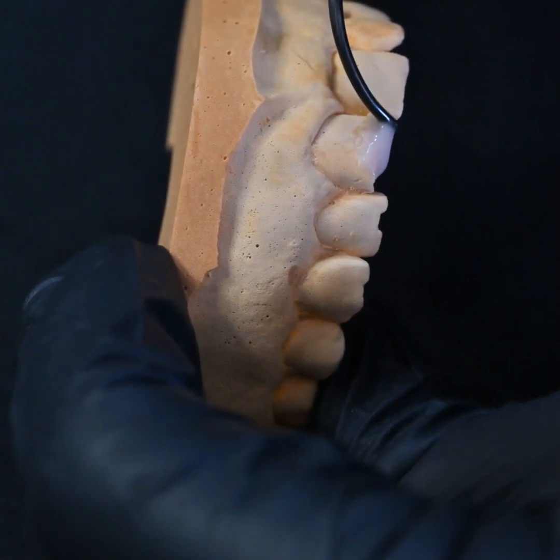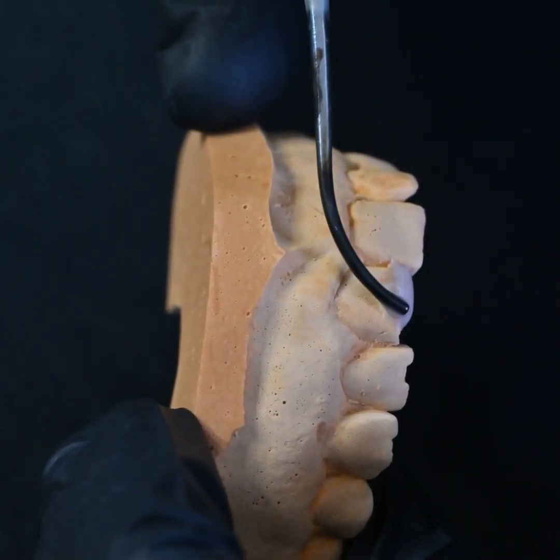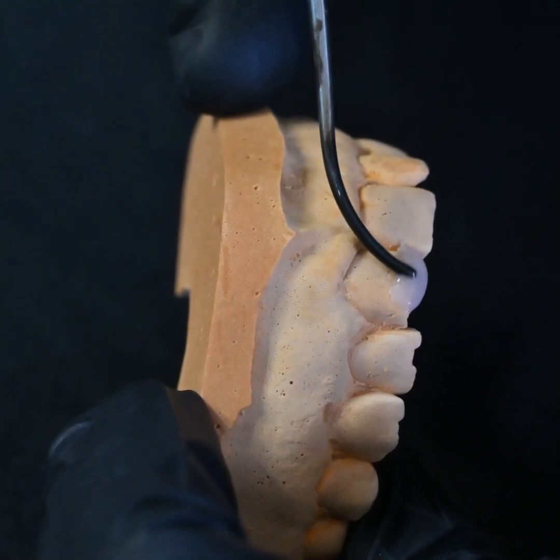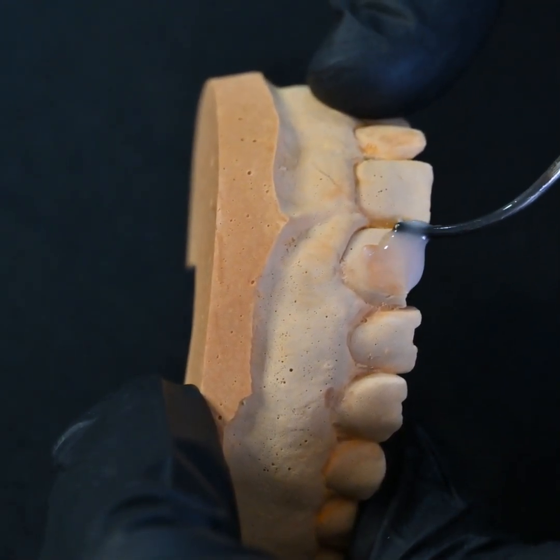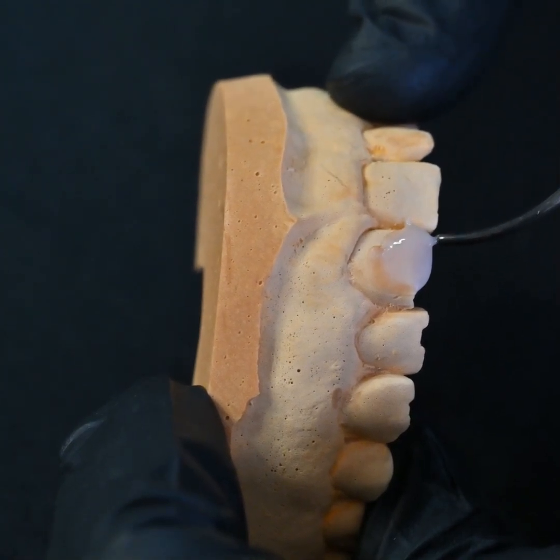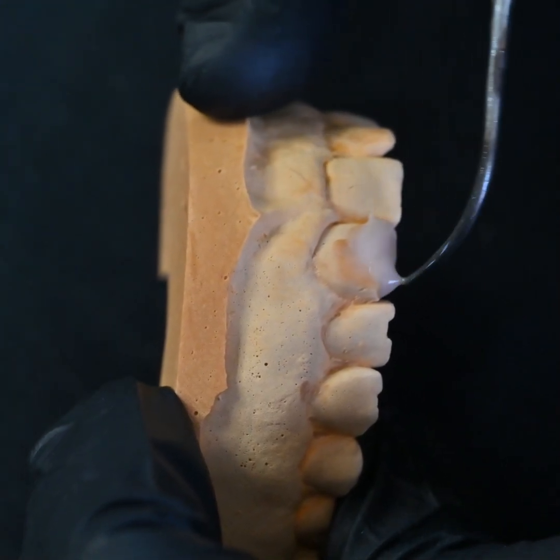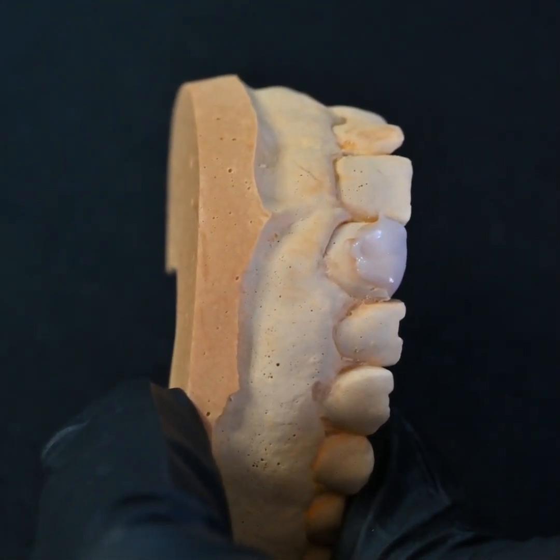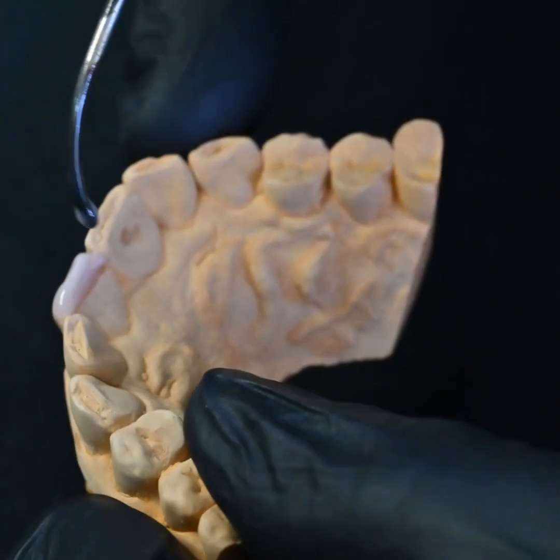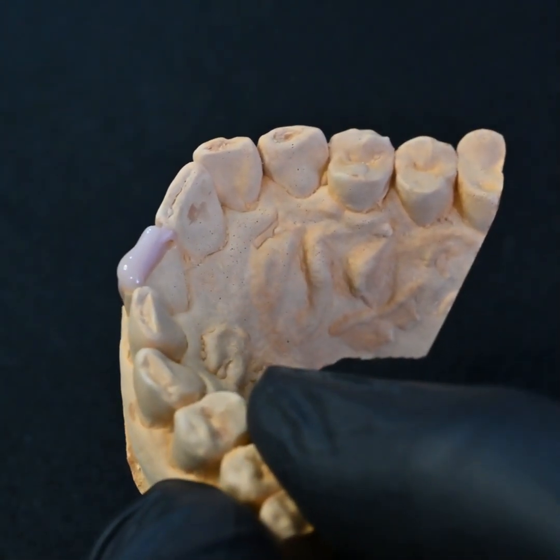With the dropper, when you carry the wax and put it on the cast, it gives you a slight room where you can sculpt it a little. If you see the video, I am not just dropping it — I am also sculpting it with the instrument. I am trying to get the anatomy of the central while I am also adding, so that I don't have a lot of work to do later.